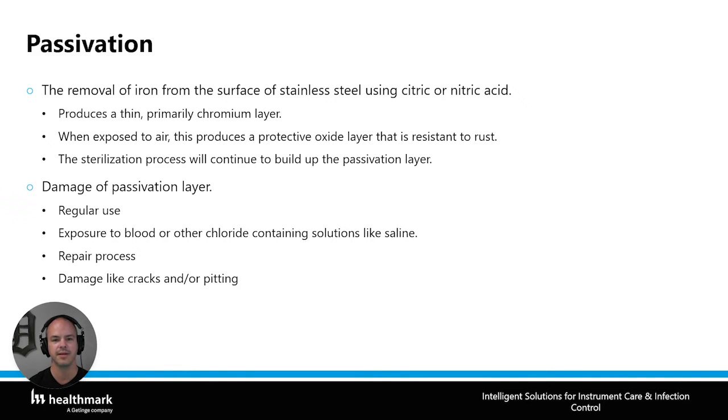Now, unfortunately, that passivation layer is subject to damage as well through regular use or exposure to blood or other chloride containing solutions like saline. So, blood or saline. Also, the repair process.